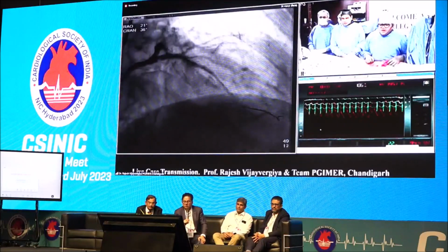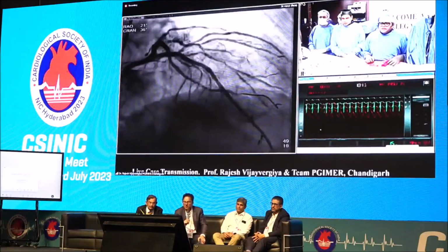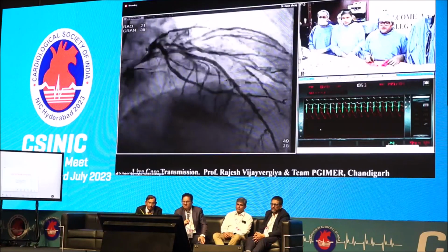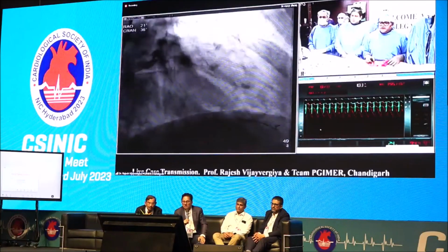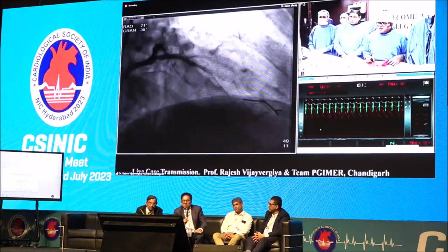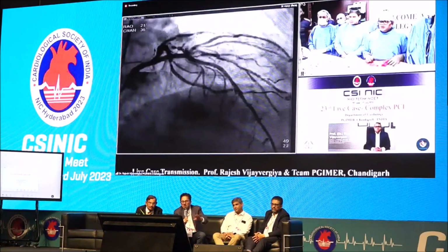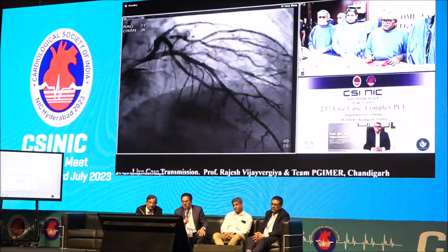Rajesh, are you going to image the ostial LAD and the left main now, or are you going to wait? Sorry? Are you going to image the left main and the LAD? No, we have already put the stent from left main to LAD at this point of time, and this is post-stenting. Right, but my point is that in my practice, I will image 100% of patients who have left main stenting, because I'm never sure if I've expanded that stent completely. It looks underexpanded in the distal left main. I'm just wondering if it would be better to image it and make sure.